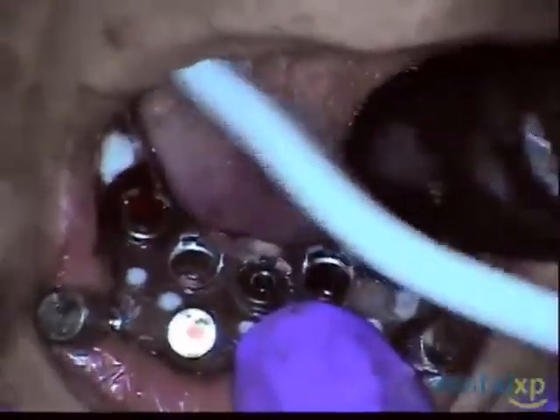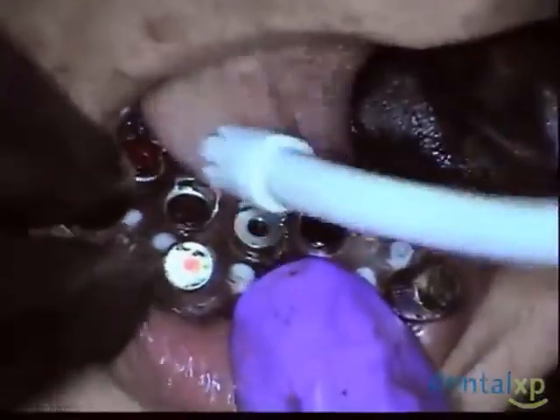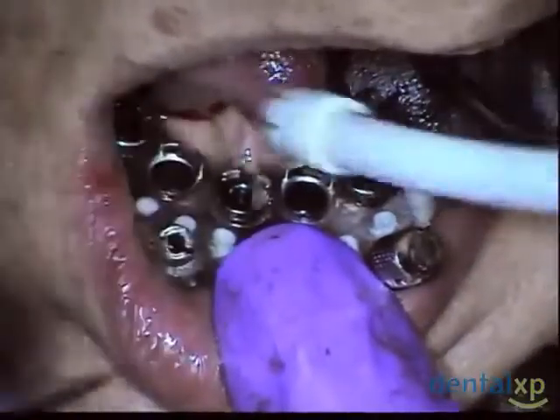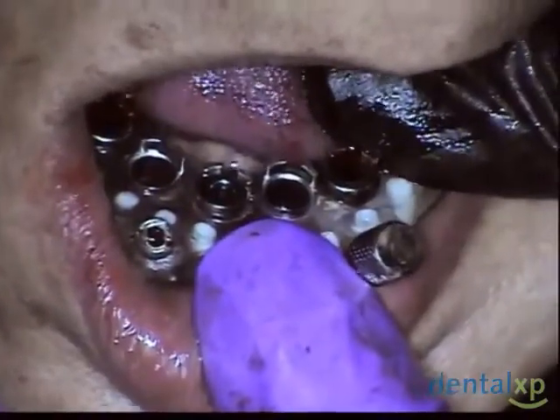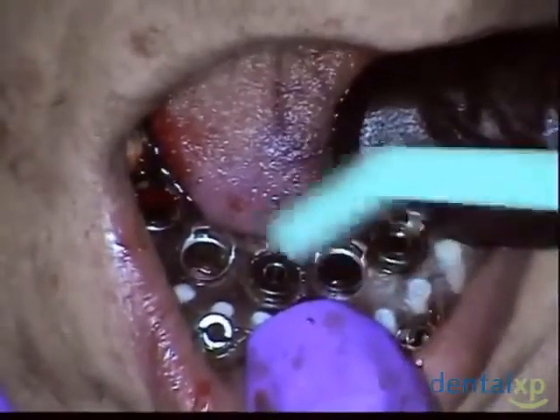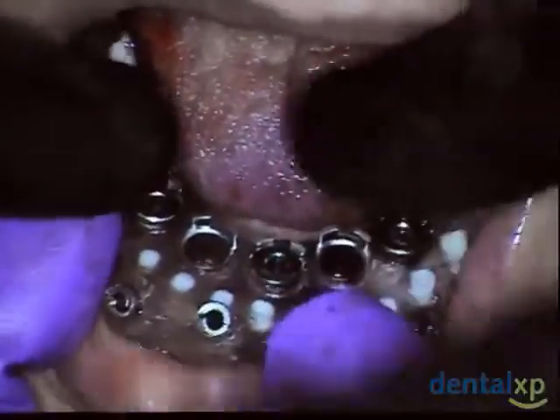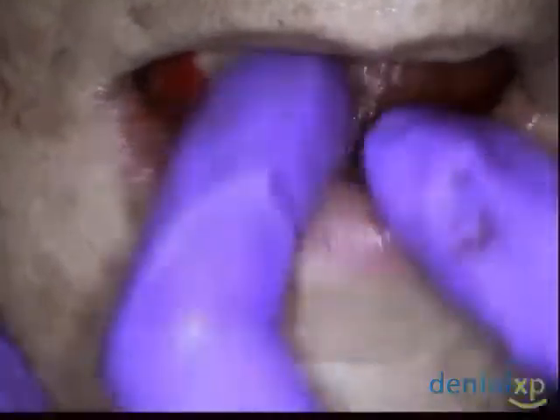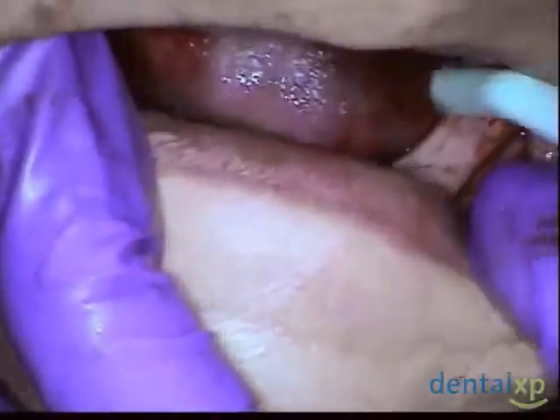Now we'll remove this. I'm going to do one more thing with our guide that I couldn't do freehand. I'm going to go in and use our countersink, and that's really kind of a misnomer. It's not a countersink. It just flattens the bone and creates a site for our abutment on our implant, female abutment, to rest. We've predetermined already that we have adequate width of bone at the occlusal surface, so I'm not going to go in and take any more bone off.